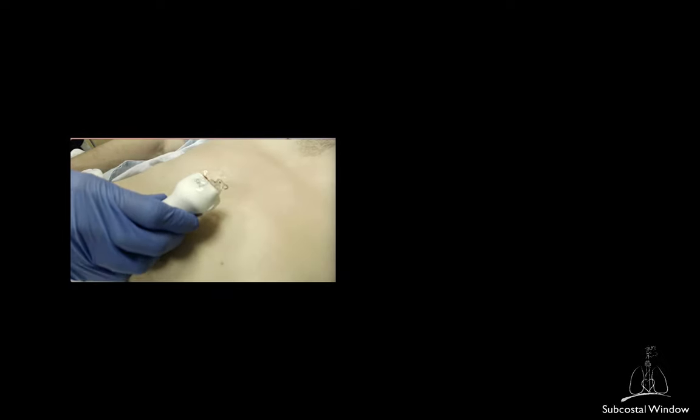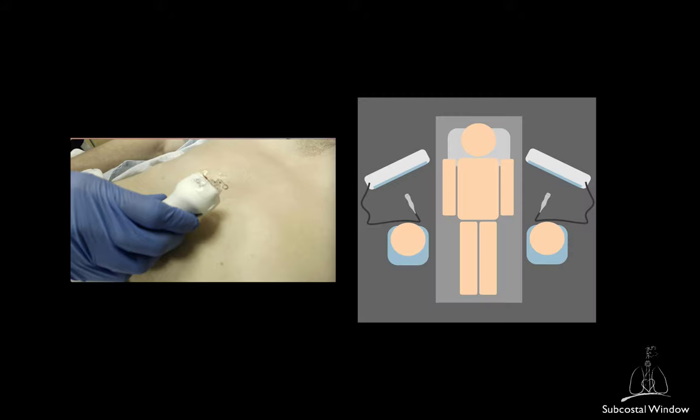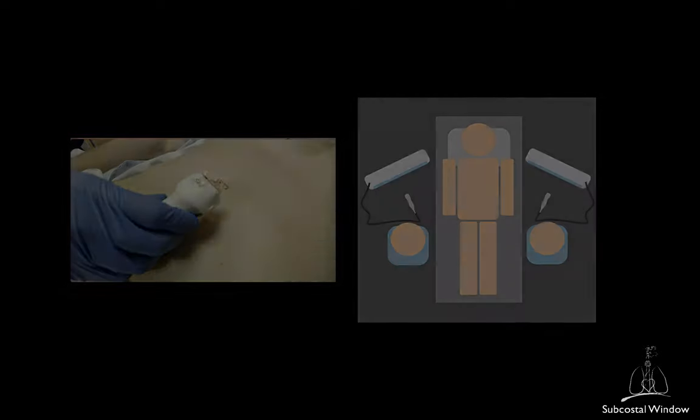To obtain the subcostal view, you will position the patient supine. To facilitate your movement, you should hold the probe from above as if you were holding a screwdriver. You can be standing on each side of the bed, but make sure that the machine is positioned in a way that you can access it to change the settings or do measurements. Also, ensure that you are in a comfortable position with the screen facing you.